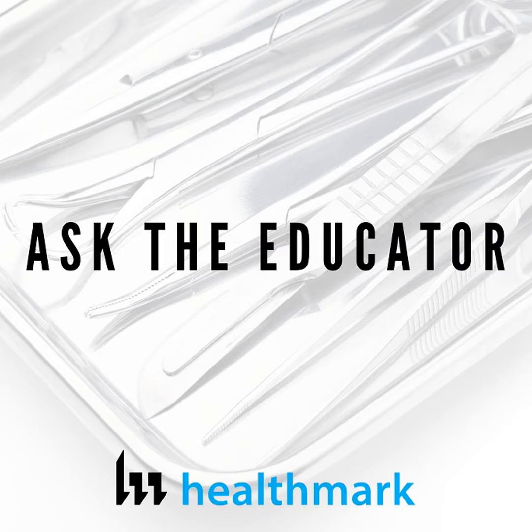There should be a double check on every set, just to make sure we got indicators, we got locks, we got filters, everything looks appropriate, it's in there properly. There needs to be a second set of eyes because of the variability of the skill sets of the technicians, particularly in a world where everybody does every job. You've got to have that in order to help prevent those trays from going to the OR.